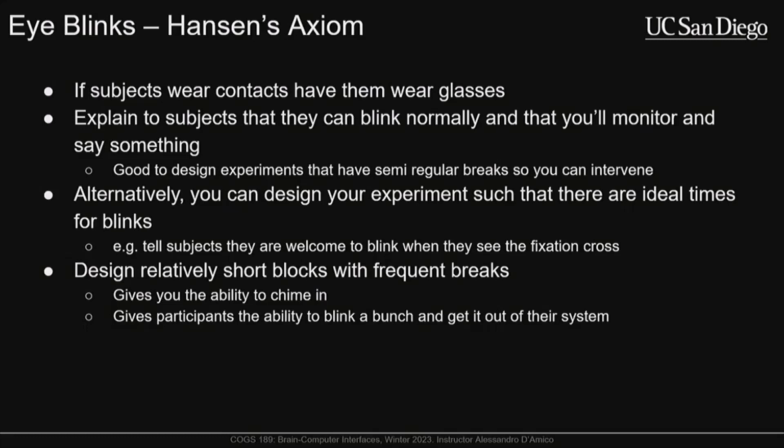And so typically you'll have the participants take their glasses off, you'll cap them, Velcro, whatever, and then we'll place the glasses back on. Now sometimes the way that the person's head is arranged and where their ears are, the glasses don't touch any of the electrodes and you're fine. Sometimes the glasses are going to be resting on top of electrodes, or in the worst case, because their frames are uneven, they'll be resting on one electrode on, let's say T7, but they're not resting on T8, which is the equivalent on the other side of the head. And that can lead to artifacts by the glasses moving, or it might cause T7 to look slightly worse than T8, whatever. Is that why you would normally have participants wear?